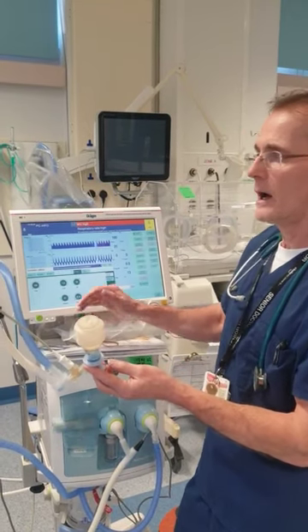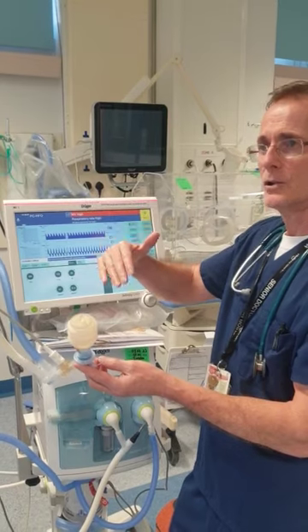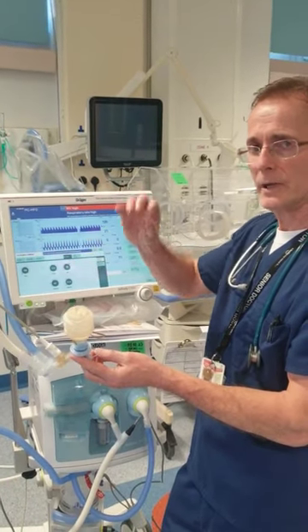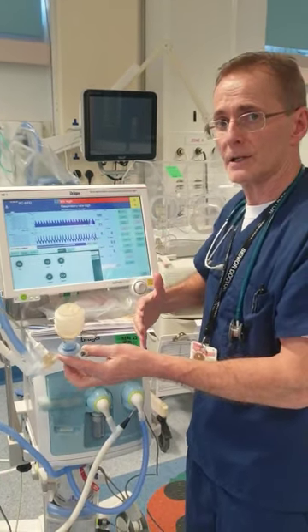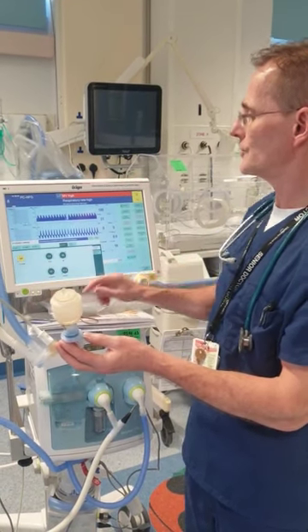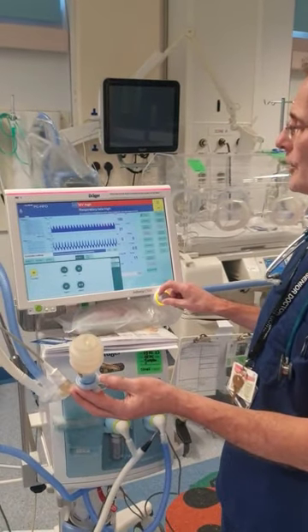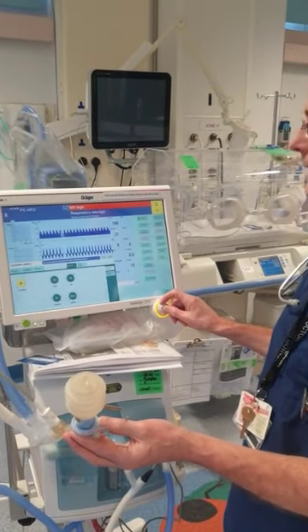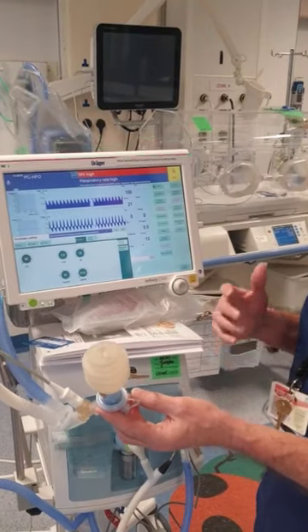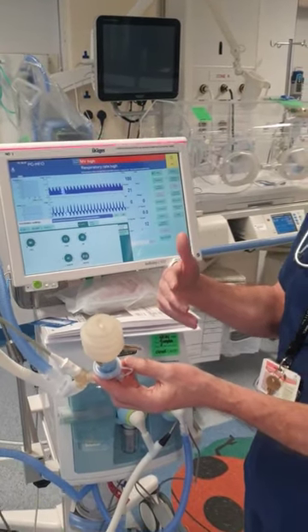I've done that, and lo and behold, the baby starts to pick up and saturations rise. So let's say the saturation is going up, up, up. That's great. That tells me I'm opening up those lungs. Well, then the thing to do is go to your FiO2 and start to turn that down. And what we want to do is incrementally turn that down, say steps of 5 or 10. And gradually turn it down to see, can we get to say 25 or 30%.